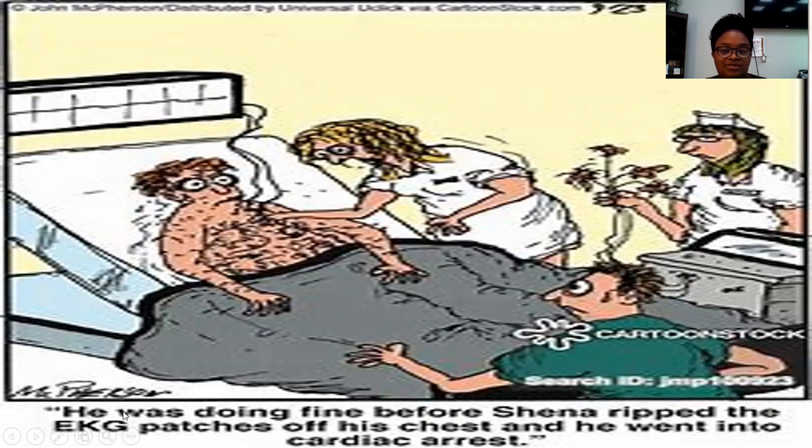The nurse says he was doing fine before Shayna ripped the EKG patches off his chest and he went into cardiac arrest. So you can imagine, if you've ever had tape or a Band-Aid stuck to hair on your arm or leg, you've felt the sting from that. Imagine somebody who has chest hair, which is usually longer and thicker, having that tape ripped off their chest. Okay, very painful. They will be upset with you, and you will not get a good report from them.